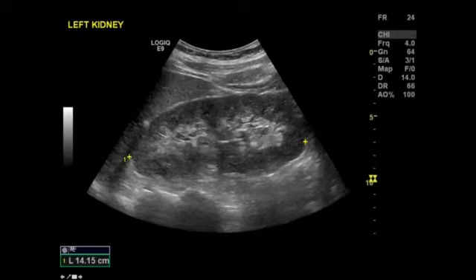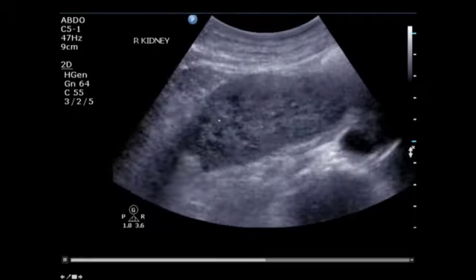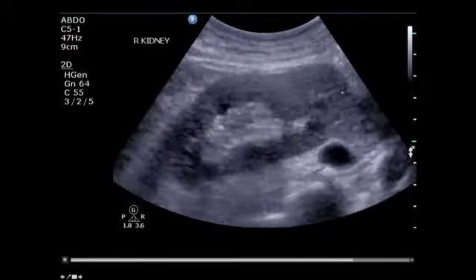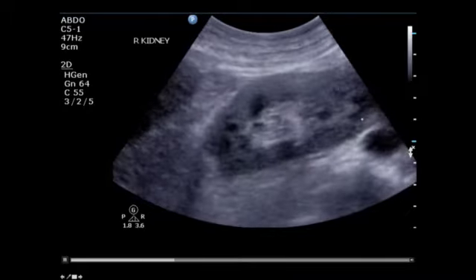This is a normal looking kidney. It's really important that you try and get to the bottom end of the kidney. So here we see the upper pole of the kidney, and then as I come down here looking for the lower pole, I think, oh yeah, there it is, but no, it's sort of going on. So that lower pole just isn't ending nicely here.